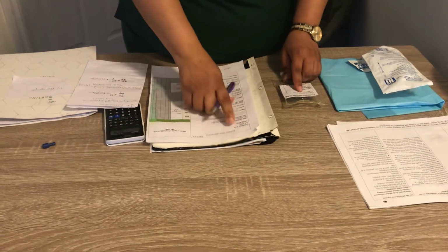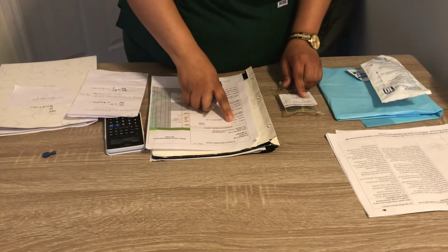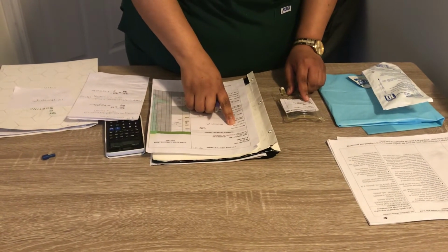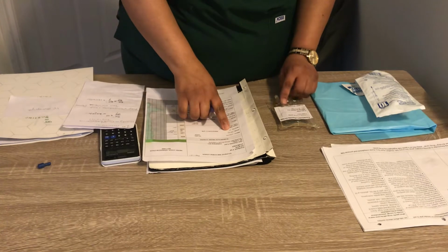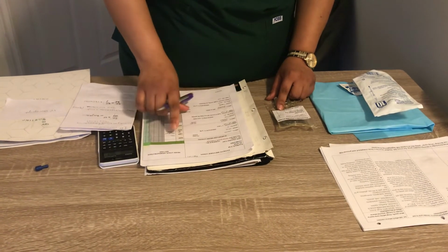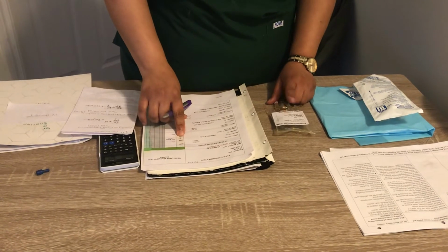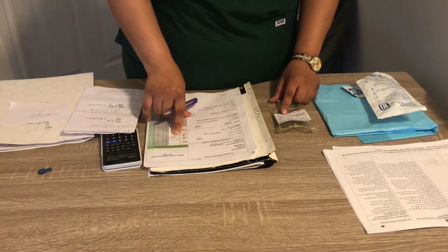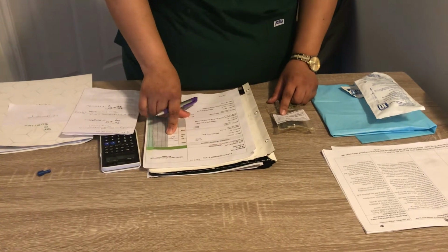So I have Mr. Sigallon. Medication is cefazolin. The dose is 500 milligrams. The route is by IV. The frequency is every 8 hours. I'm given the 1400 medication. The site is going to be at the patient's right arm, and the reason is for post-op infection.